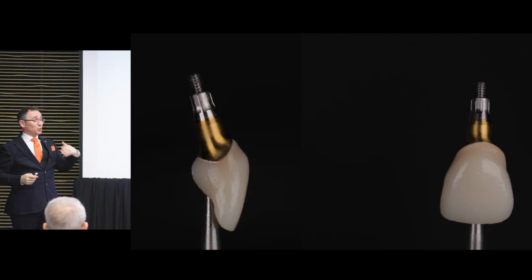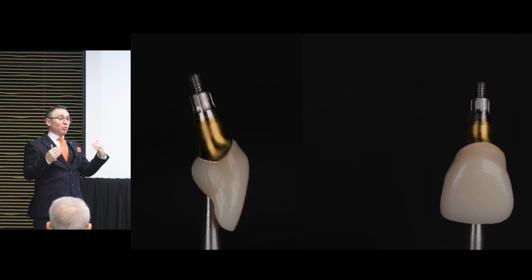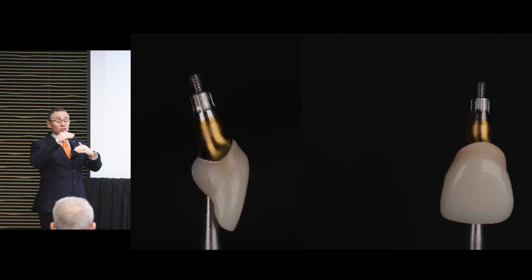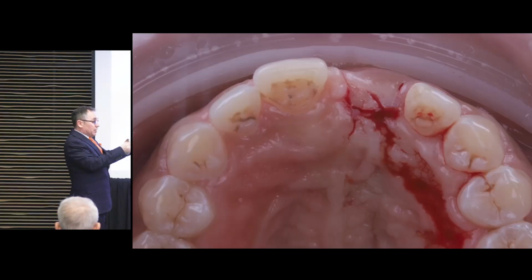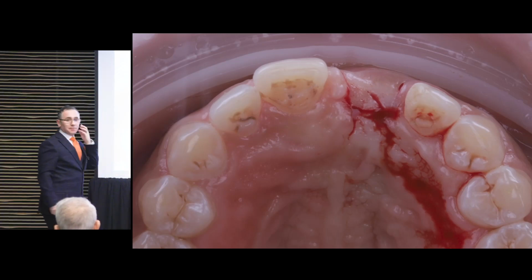And Martin's constant badgering at me was, higher, go higher, because we're not seeing the tissue receding. We are seeing it being stable, so it's having the confidence now to know that, in fact, those 3s and 4s that he was talking about, we're utilizing them a lot more now. So that's why we're getting the contour with the titanium, less with the zirconia these days.